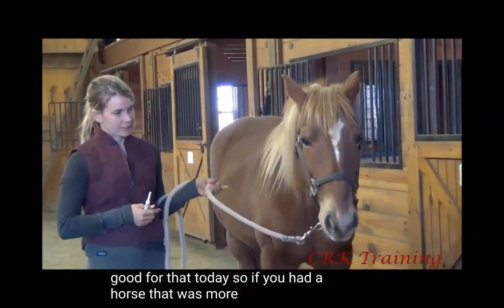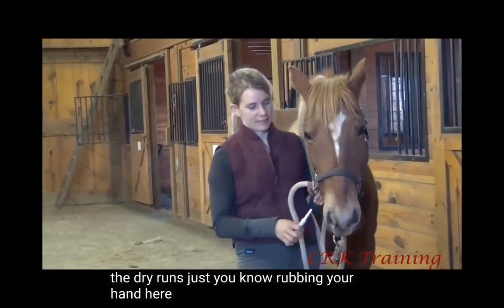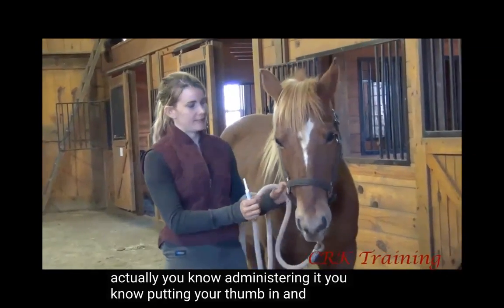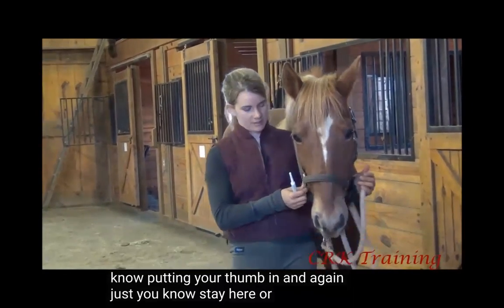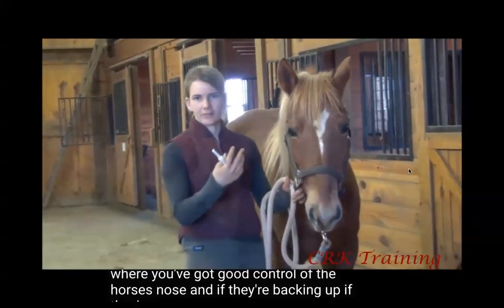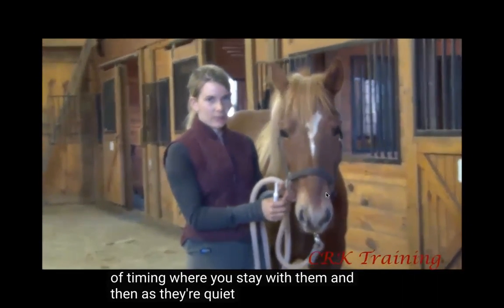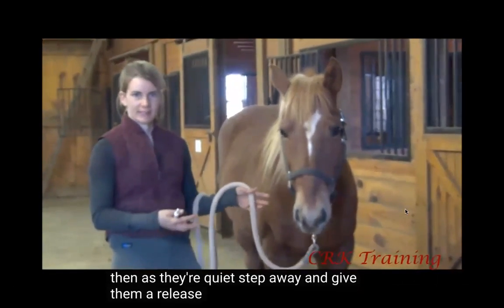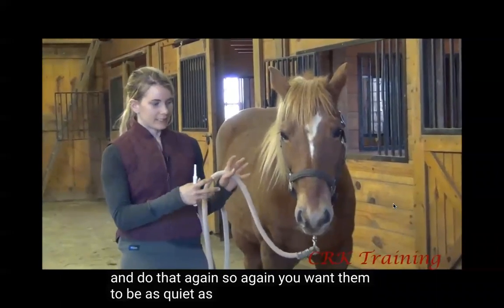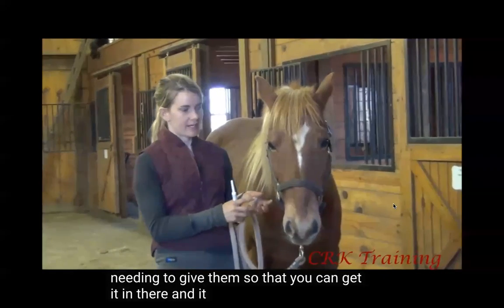So if you had a horse that was more difficult, you would spend a little bit more time doing the dry runs, just rubbing your hand here, putting this in without actually administering it, putting your thumb in. And again, stay here where you've got good control of the horse's nose. And if they're backing up, if they're doing whatever, use the concepts of timing where you stay with them. And then as they're quiet, step away and give them a release. And then you can come in and do that again. So again, you want them to be as quiet as possible when you go to actually administer whatever you're needing to give them, so that you can get it in there and it stays in there.